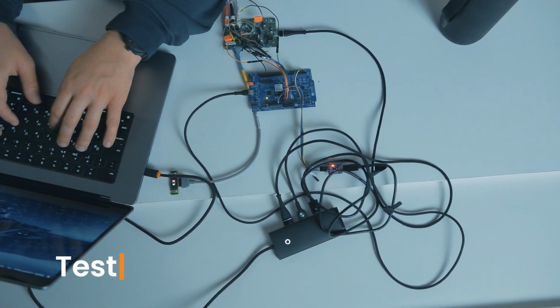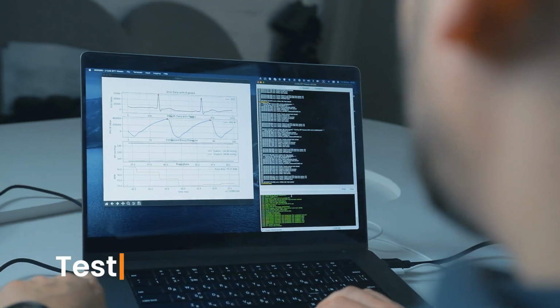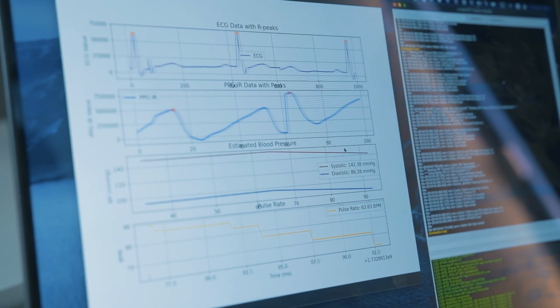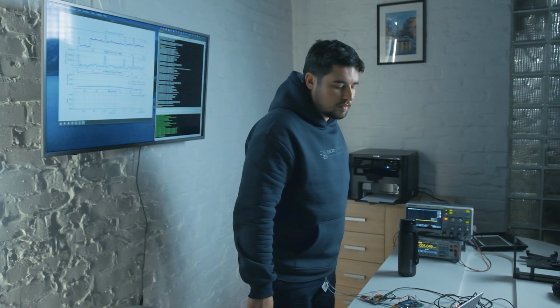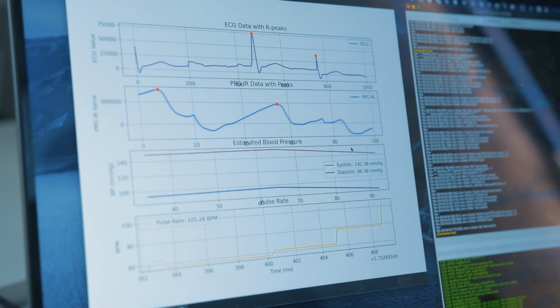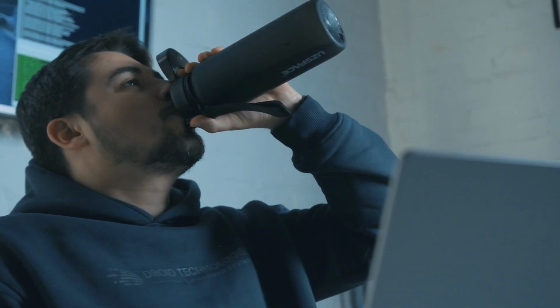After connecting the electrodes and all components, launch the application to conduct a simple test. The first measurement will be taken at rest, where we observe a lower heart rate. For the second measurement after exercise, we will see an increase in this value and can observe how it gradually returns to baseline.